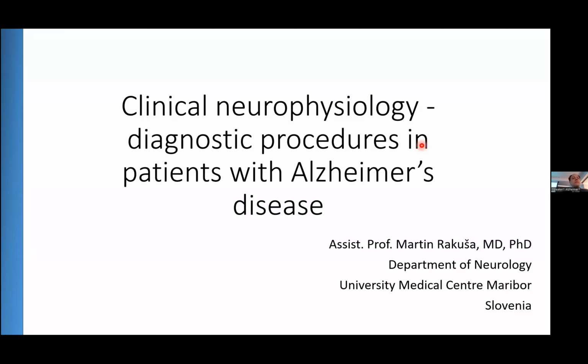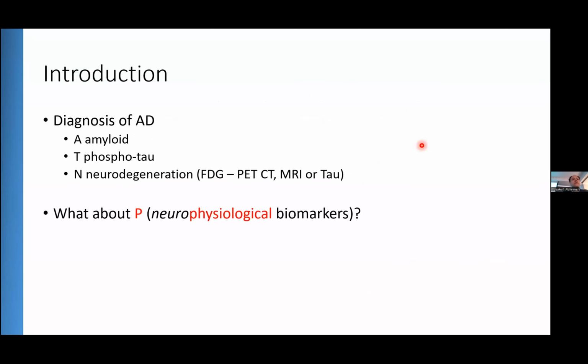In the next few minutes, I'm going to present the clinical neurophysiology diagnostic procedures in patients with Alzheimer disease. As you all know, the diagnosis of Alzheimer disease is based on clinical criteria. To enhance this, we also use biomarkers. And it's very easy to remember.